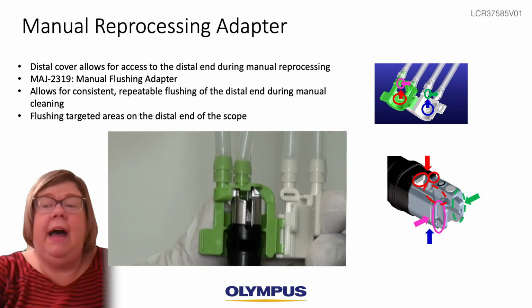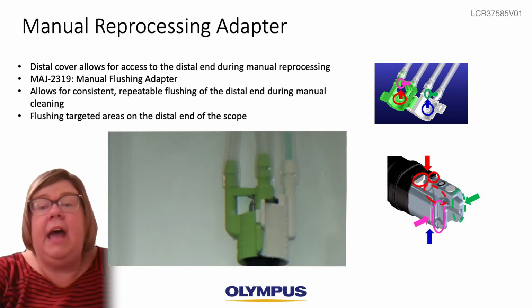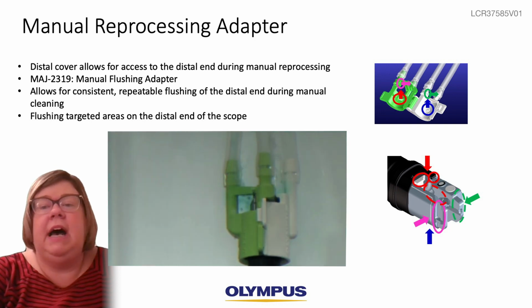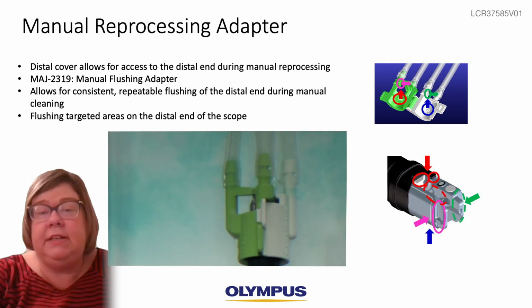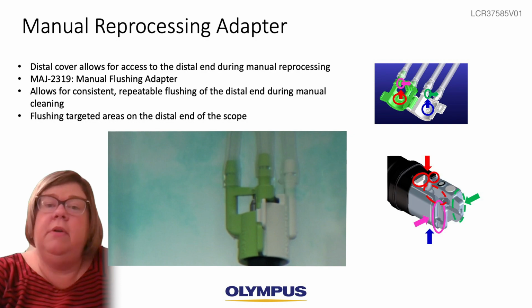In the endoscopy lab, the nurses and technicians like things to be simple, because that helps it to be consistent for all staff. Our goal as the endoscopy staff is to take care of the patient on the table, as well as the capital investments and hospital equipment that we are provided to work with day in and day out.